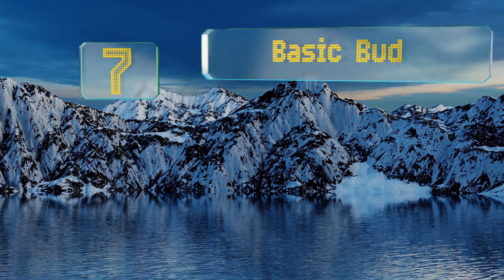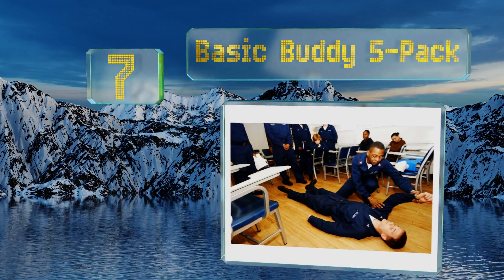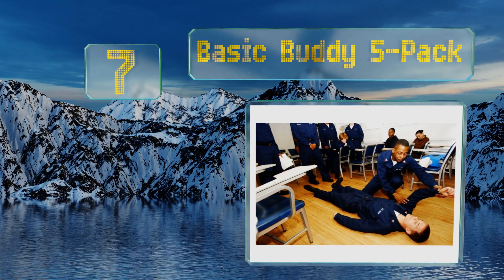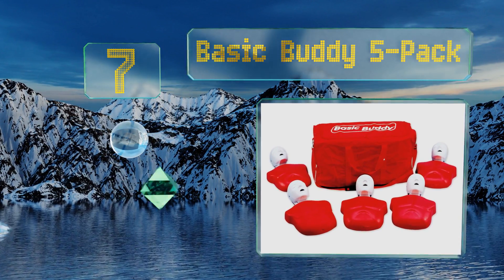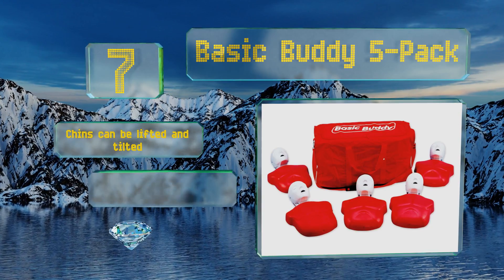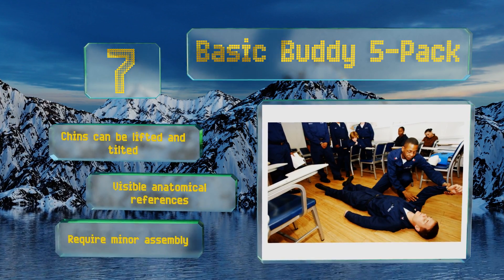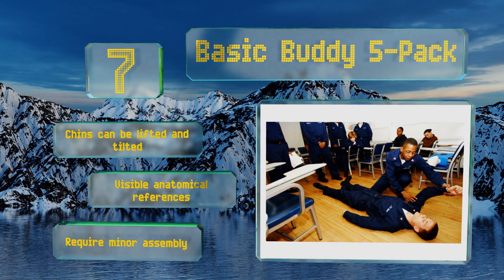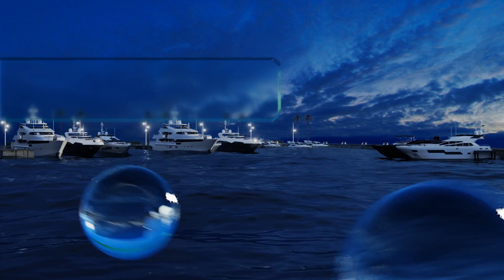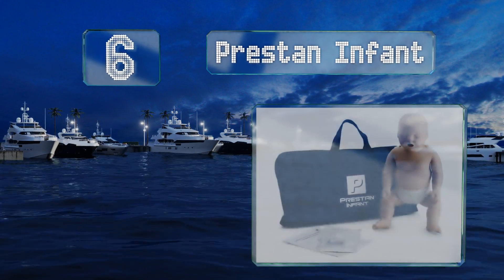At number seven, the Basic Buddy five-pack are torso-only models that are lightweight enough for easy transport and positioning. They come with 50 disposable lung and mouth systems that allow you to keep them sanitary when training multiple students in one class. The chin can be lifted and tilted and it includes visible anatomical references, but they do require some minor assembly.